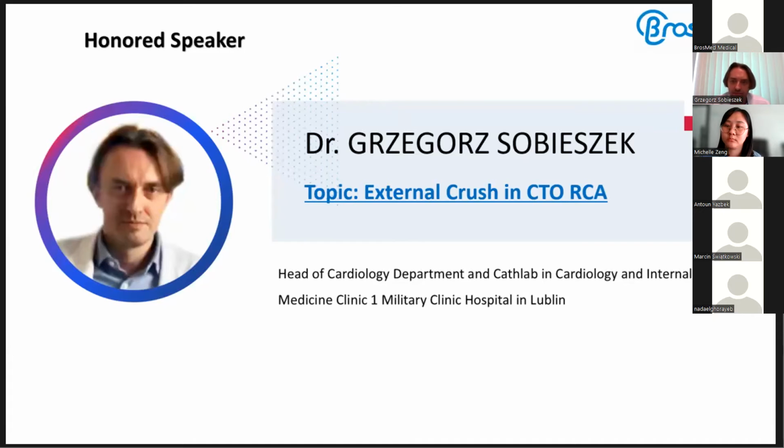Do you have the Crosser system? Excuse me? There's a Crosser. Crossbus? No, Crosser. CROSSER, Crosser system. It's an ultrasound wave emission. It's like a balloon catheter that emits some waves. You mean lithotripsy or something different? No, something different. I don't have it.